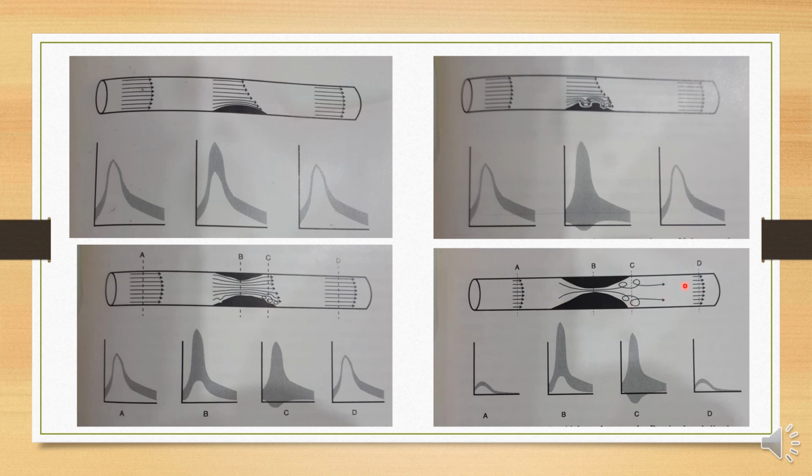And if there is a severe congestion as a bottleneck, then the traffic which is moving centrally will speed up when it comes out. So that is the basic pattern which we use in determining the velocity and the percent of stenosis. We'll discuss that later, and how this is shown on the spectral waveform.